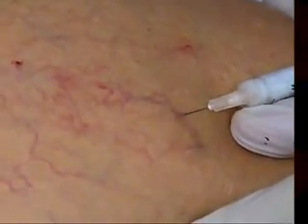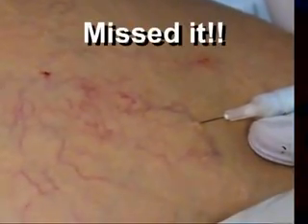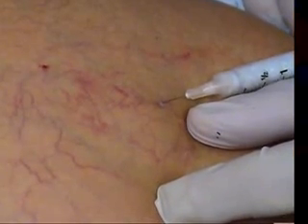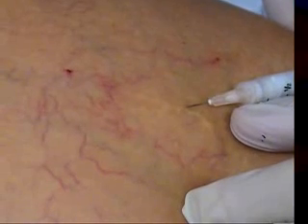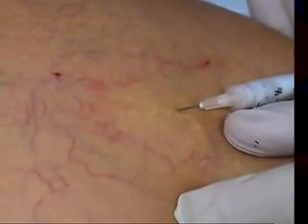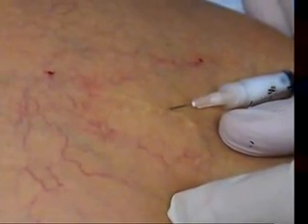Let's go in here. It's a nice deep one here. Now there I'm a bit worried about extravasation, so I'm going to come out. Let's go in here. That looks good, huh? Now this stays foamed for about a minute or two, and after that you find the foam is lost in the syringe, so you want to come on out then probably and foam it up again.